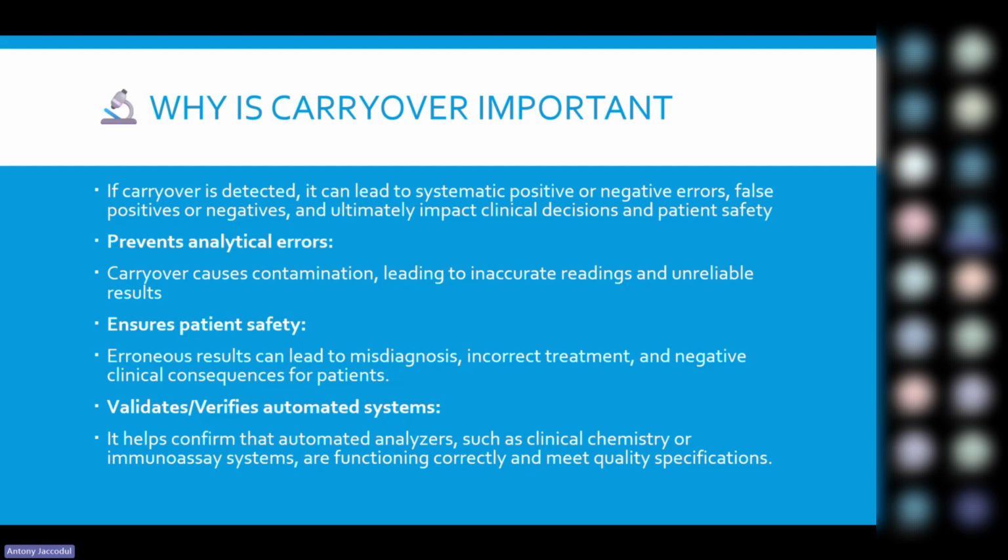So why is carryover important? If carryover is detected, it can lead to systematic positive or negative errors, false positives or negatives, and ultimately impact clinical decisions and patient safety.